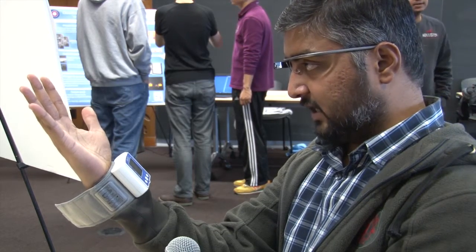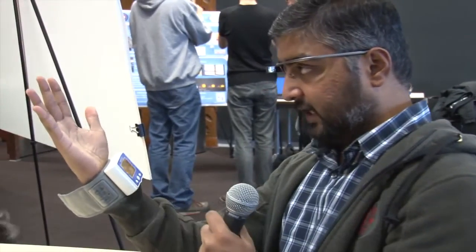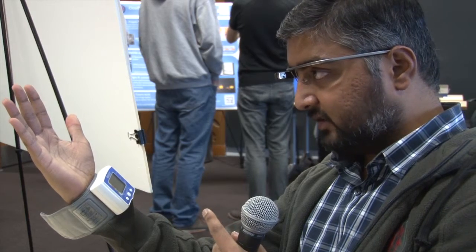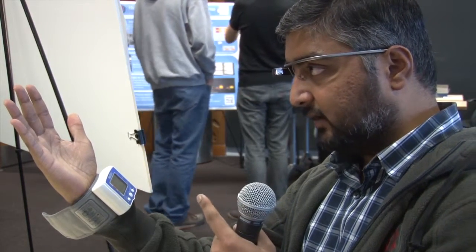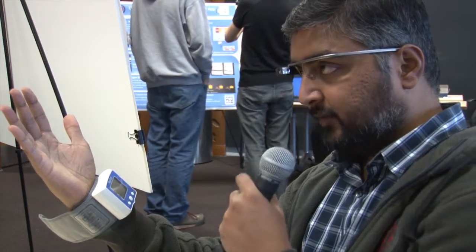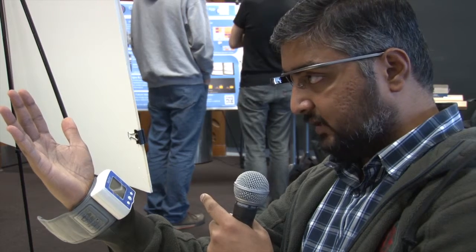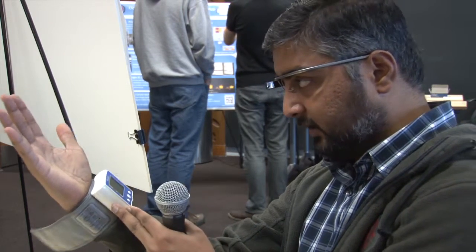Okay, it is now giving me the instruction to place my hand on the table and rest my elbow. Okay, Glass assistant. As you notice, I've started giving voice commands from now. The computer vision code is over. The device detection and hand recognition was successful. From now on, it is basically automating the task by hearing instructions and telling Glass that we are complete.